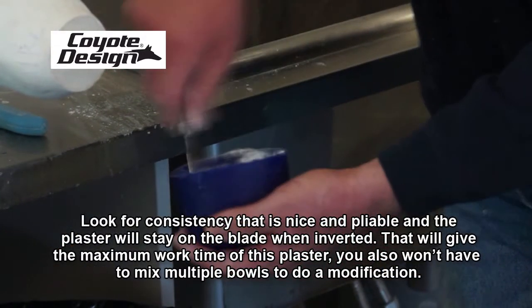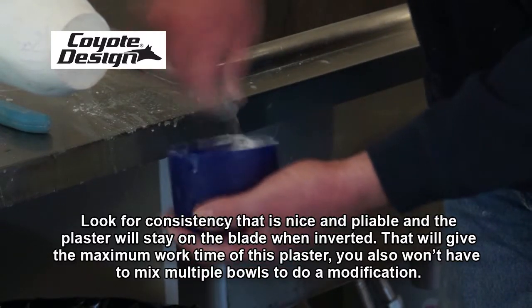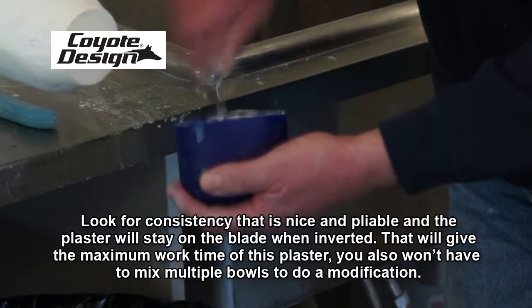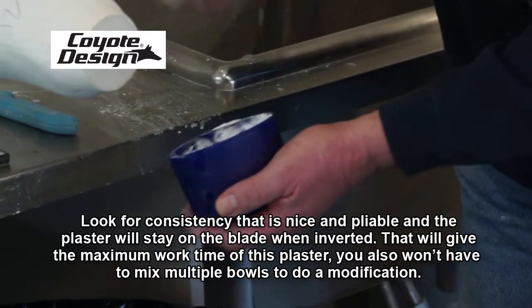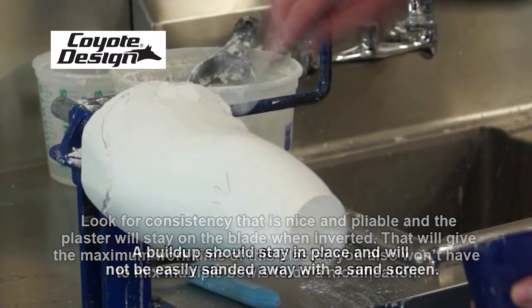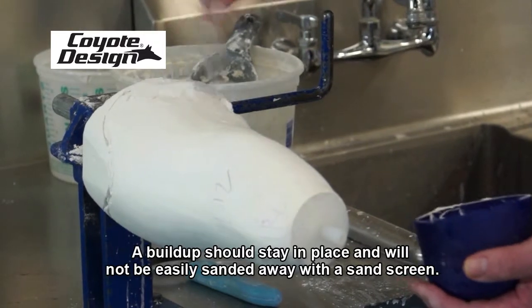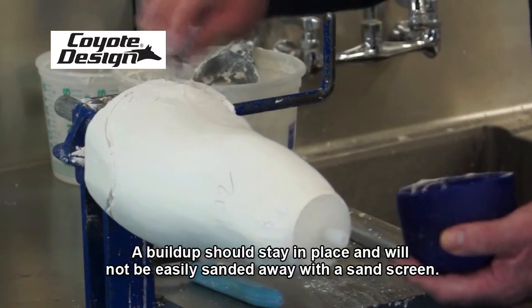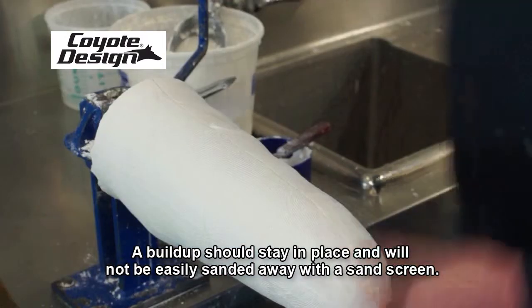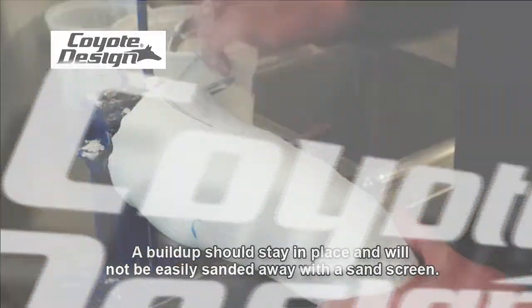We're looking for a consistency that's nice and pliable and the plaster will stay on the blade when inverted. That gives the maximum work time so you don't have to mix multiple bowls to do a modification. It will spread nicely and smoothly, and if you do a buildup, it will actually stay there and not be easily sanded away with sand screen.